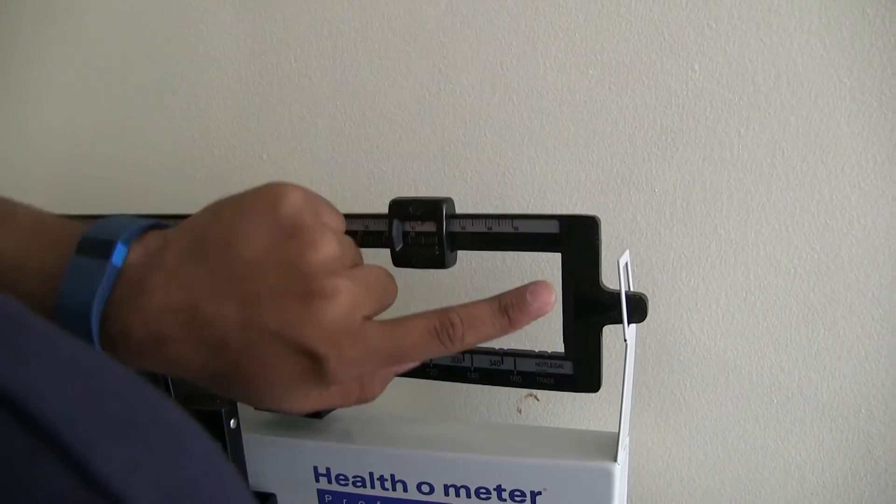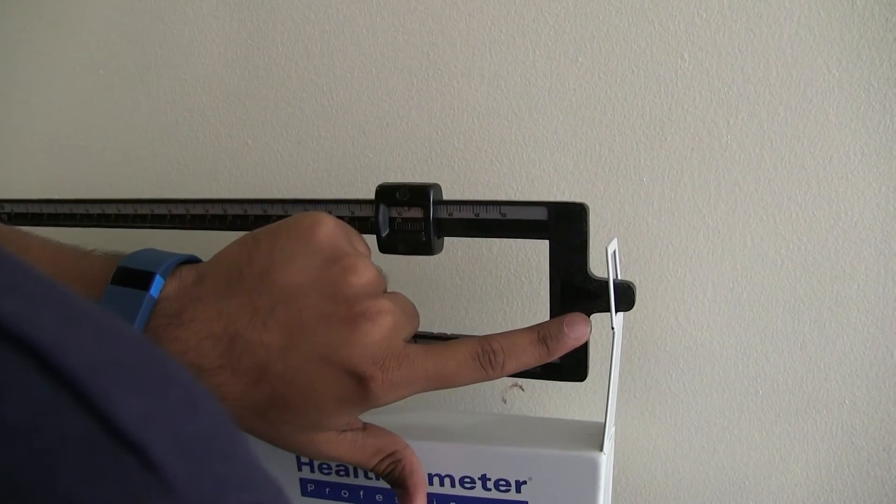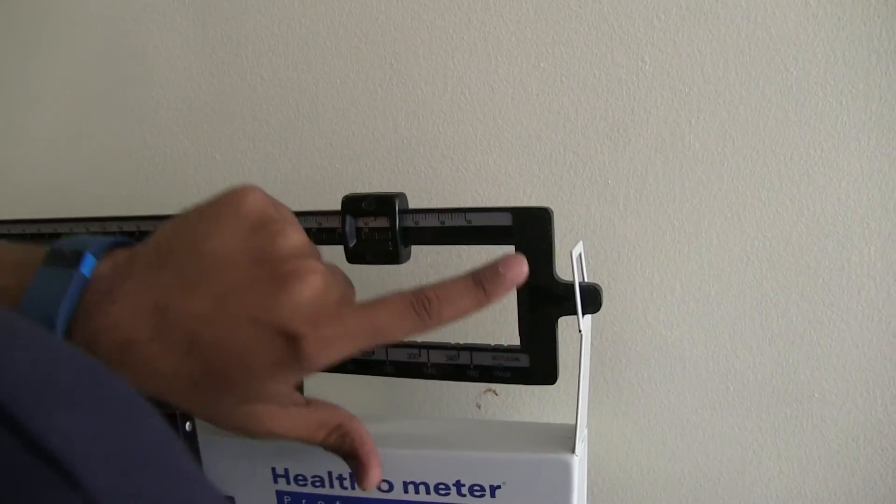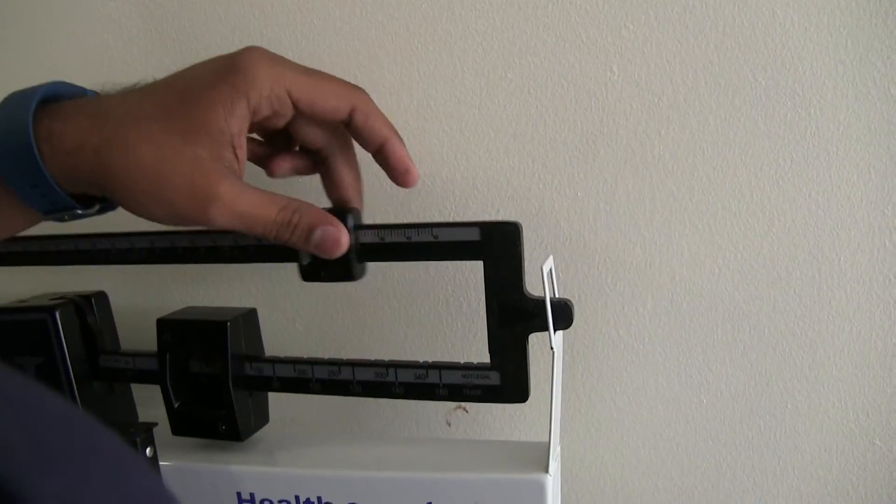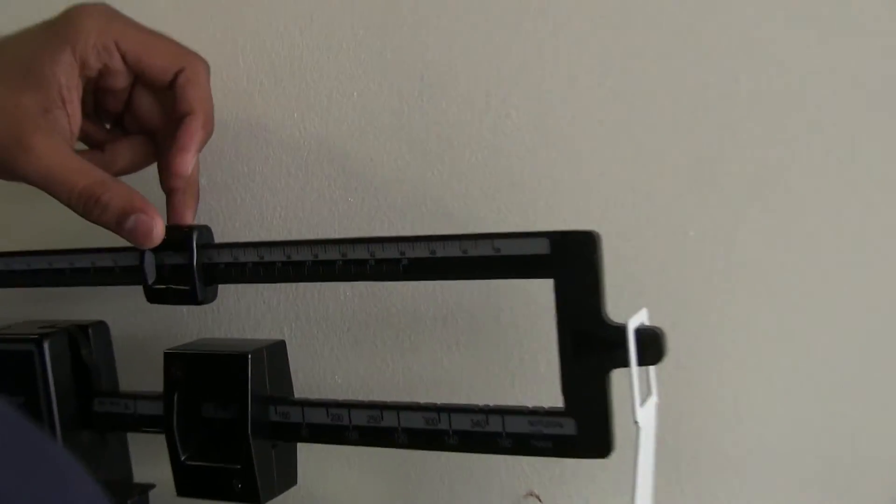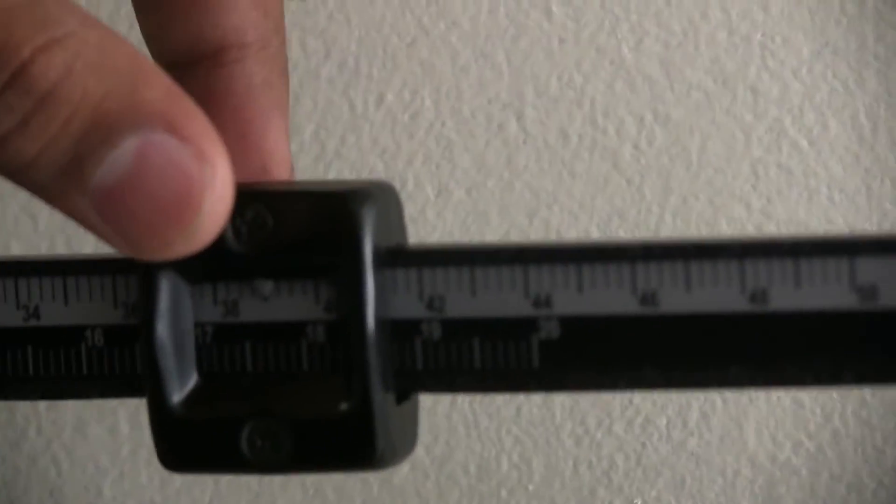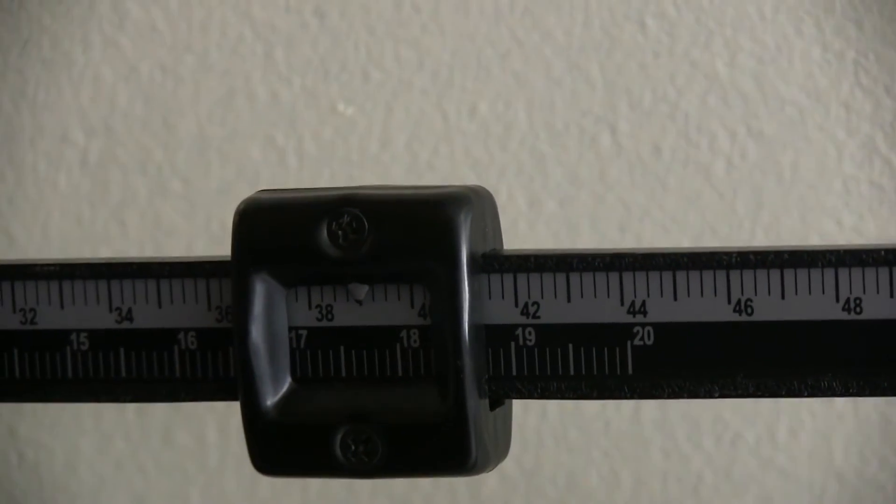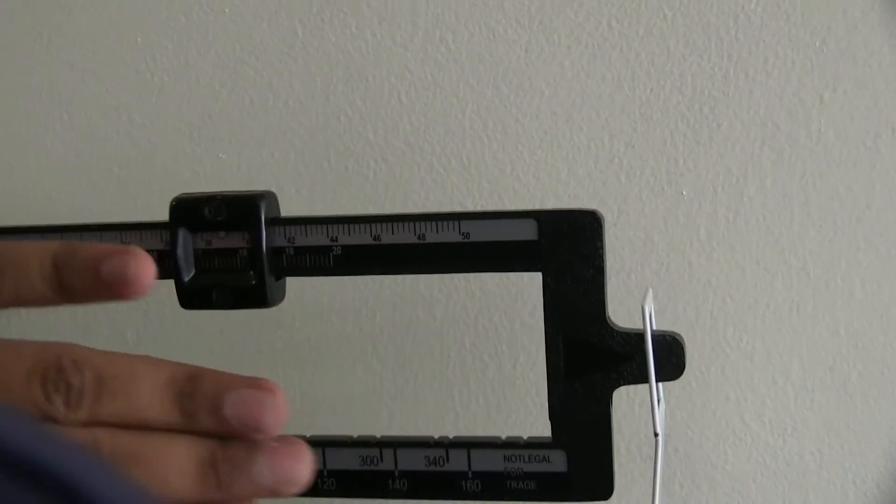Whenever the scale is at the bottom over here, it means that the weight, I'm at a higher number than their weight and then if it's on the top, that means I'm at a lower number than there. So I just like to move it around slowly to get to a number where it's approximately in the middle.